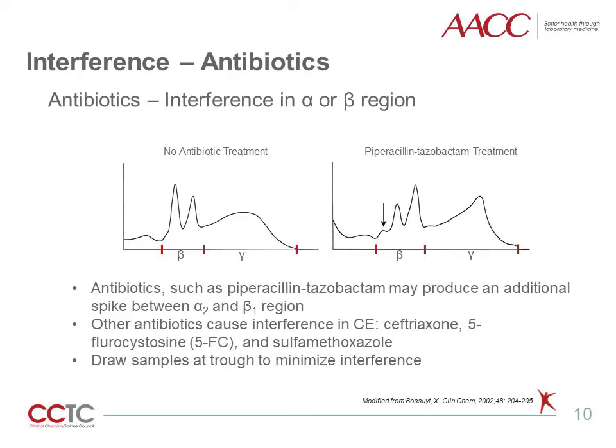Antibiotics also cause interference in CE due to absorbance at UV wavelength and appear as a monoclonal band in the alpha or beta regions. For example, piperacillin-tazobactam administration generated a small peak at the anodal site of beta-globulin, which was not present when the sample was collected before its administration. Other antibiotics that cause interference in CE include ceftriaxone, 5-fluorocytosine, and sulfamethoxazole. Immunofixation can be utilized to rule out interference due to antibiotics. Interference may be reduced by drawing the electrophoresis sample when the antibiotic is at trough concentrations.